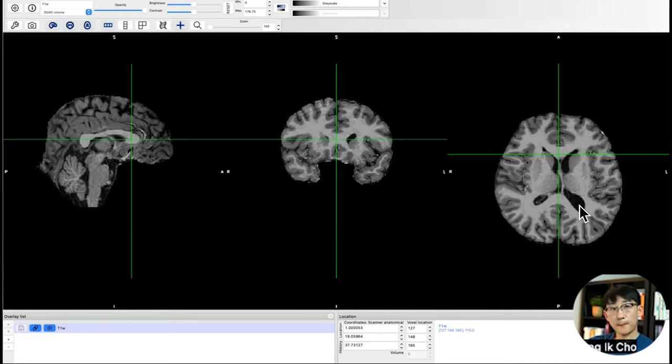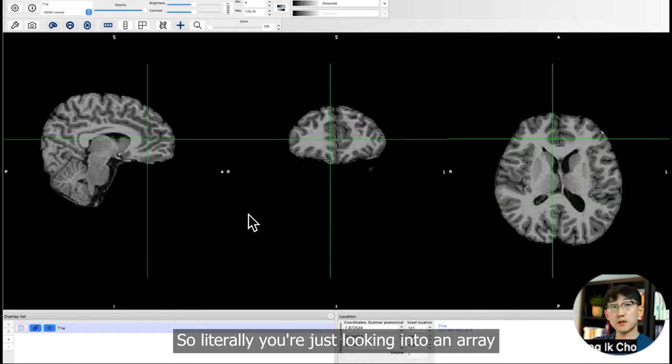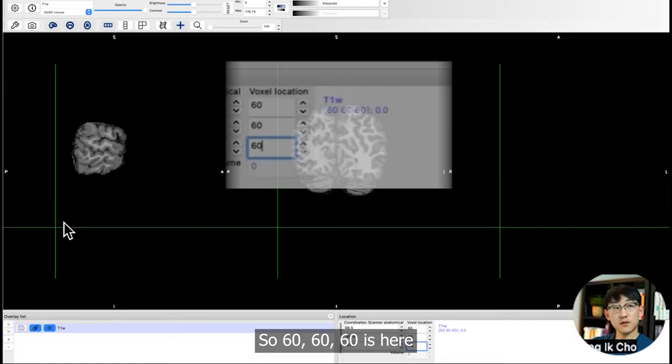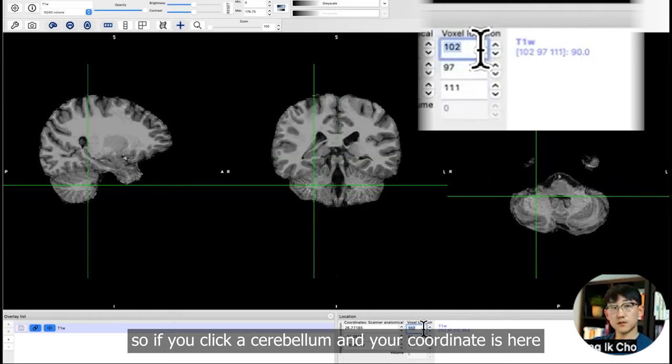This was brighter, higher number. Darker, lower number. The gray matter is somewhere between, like 61. Literally, you're just looking into an array. So you can find the location of voxels using a number like this: 60, 60, 60 is here. If you want to look at the coordinates, if you click here, if you click the cerebellum, then your coordinate is here.